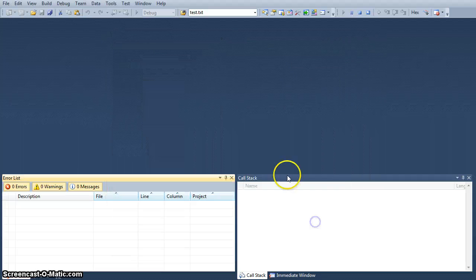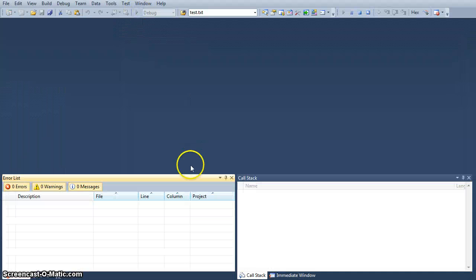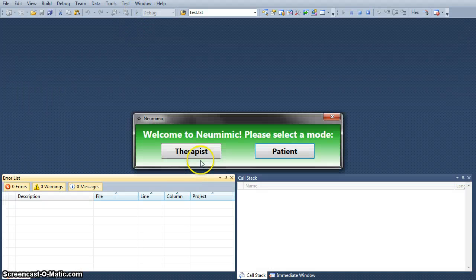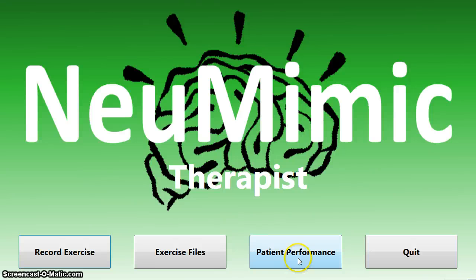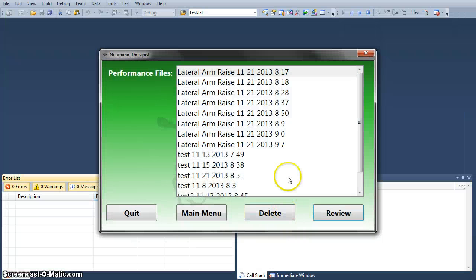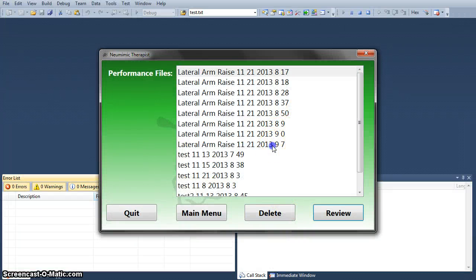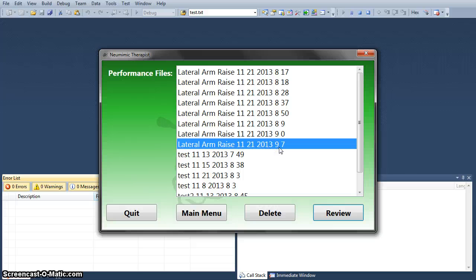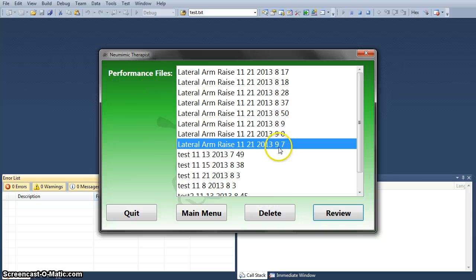We are going to go back into therapist mode. We are going to review patient performance as the physical therapist. We are going to do the exercise performed on 21 November at 09:07.